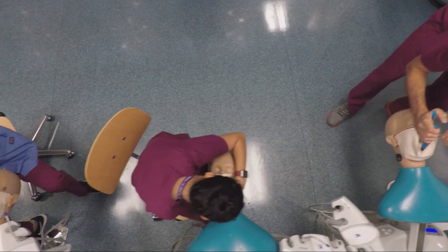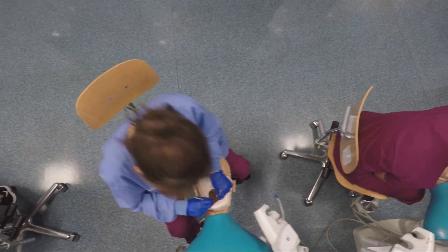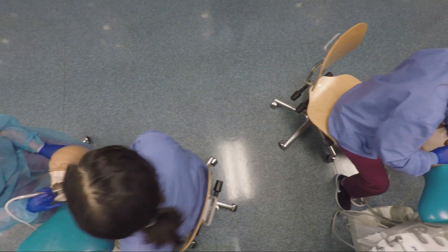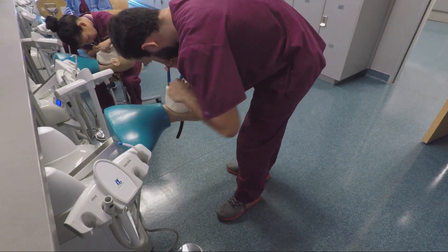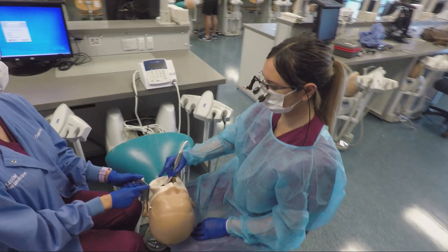Take a look into any simulation lab and probably any dental school and you may see something similar. Before there was four-handed dentistry, clinicians have been operating in a variety of styles. Like everything around us, dentistry has evolved, including how we position ourselves in the operatory. Ever since the dawn of civilization, we've been keeping up with technology, and the same is true with dentistry today.